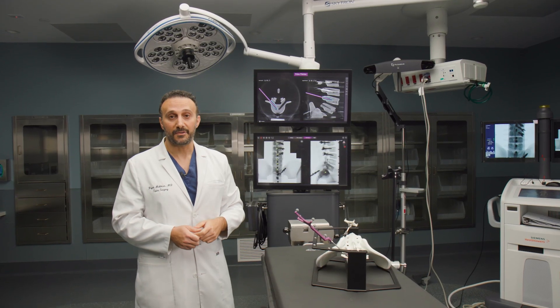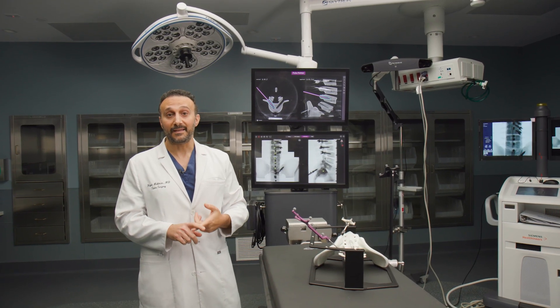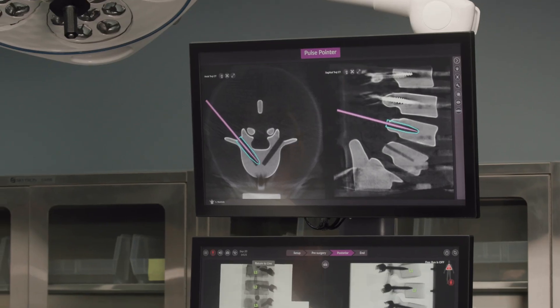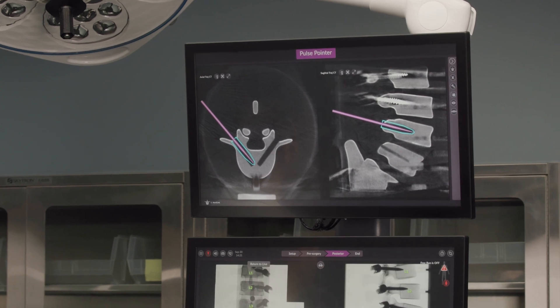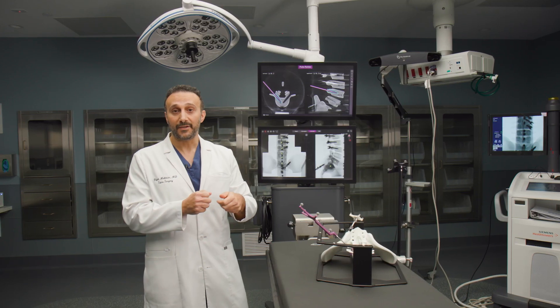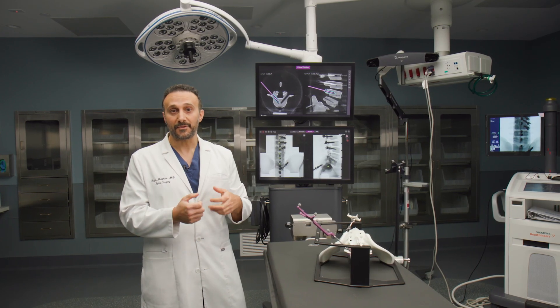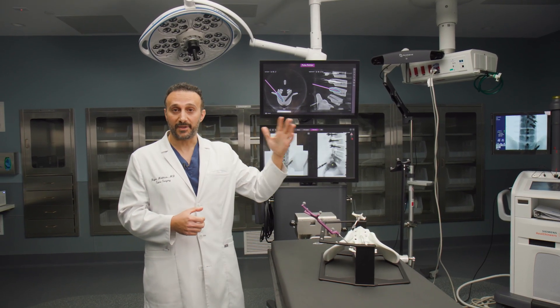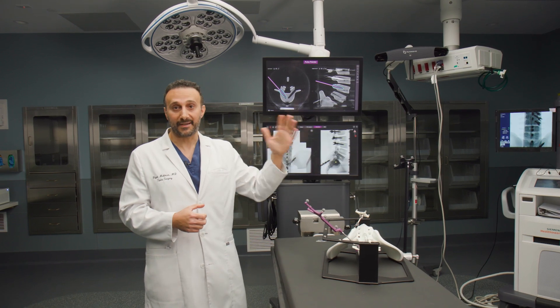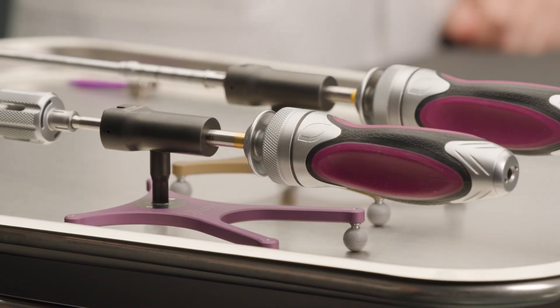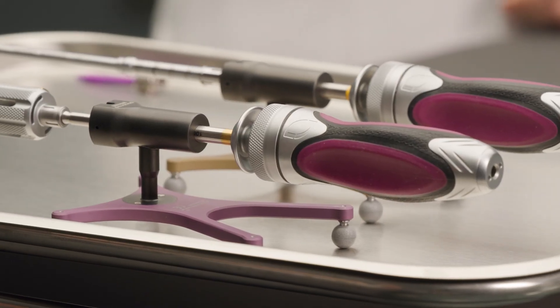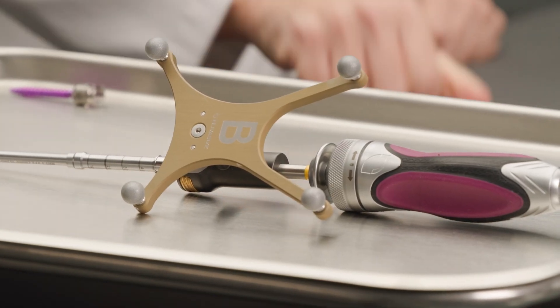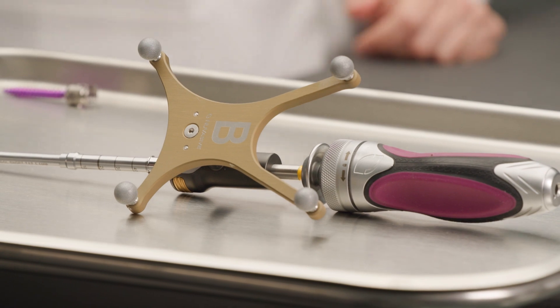It lets us measure the length and diameter of those screws, and if there's any question after we've changed the shape of the spine and we want to check things, we can always bring the platform back in for another acquisition of images and see what it looks like before and after to make sure that we've accomplished the goal.